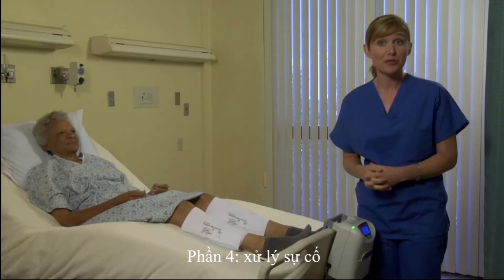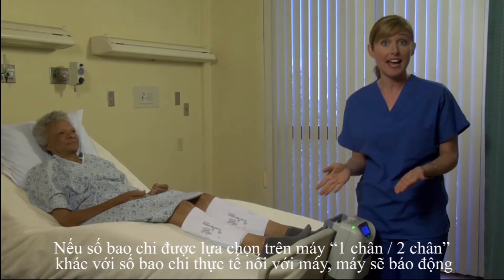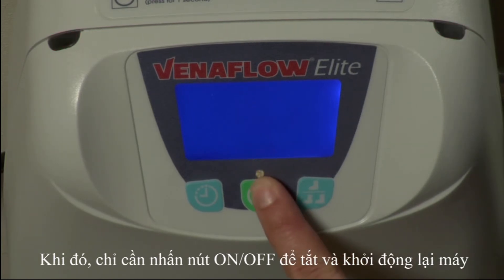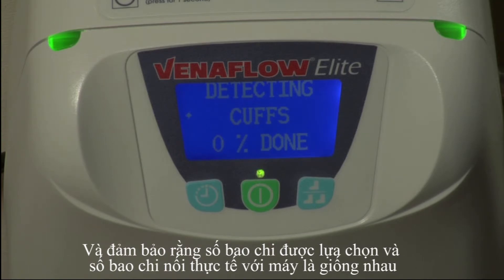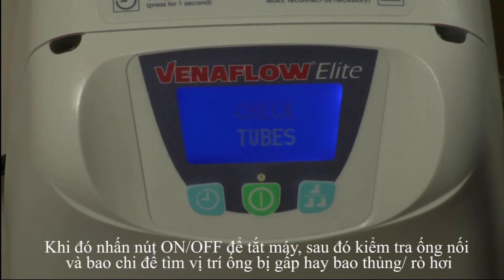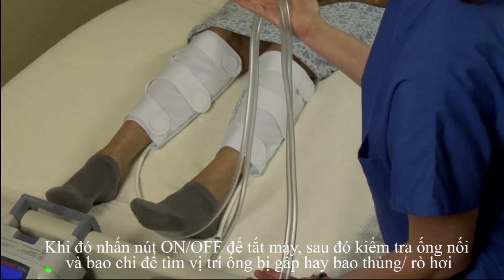Now we're ready to troubleshoot. If there is a discrepancy between what the device detects and how many cuffs are attached, the device will go into a leg alarm. If this happens, simply press the green on-off reset button and ensure the screen and the number of cuffs attached match. If there is a leak or kink in the tubing or cuffs, you may get a check tube alarm. If this occurs, press the green on-off reset button and check tubes and cuffs for obvious leaks or kinks.